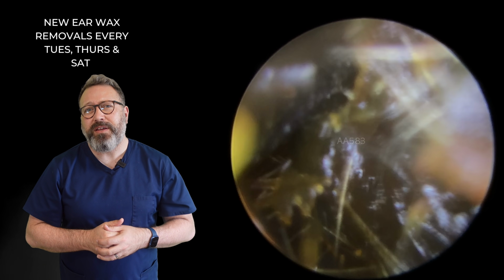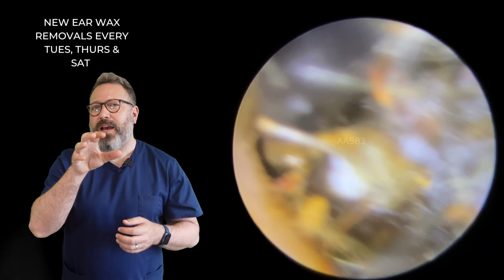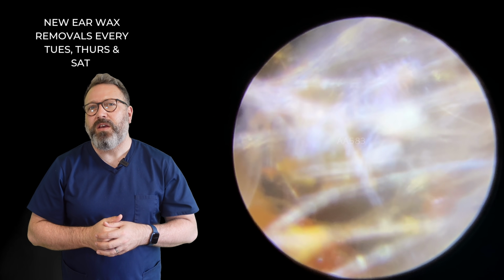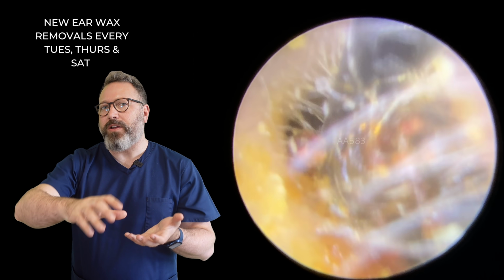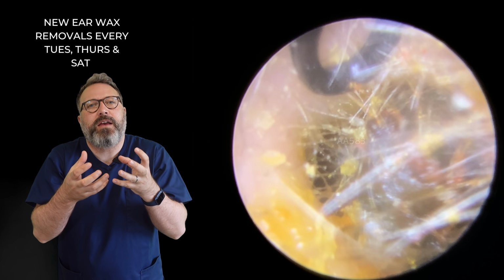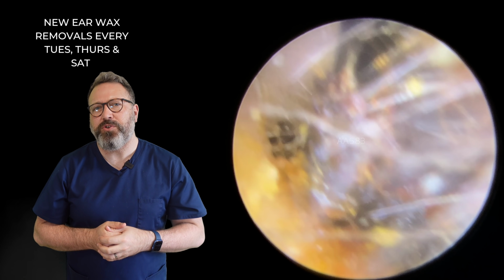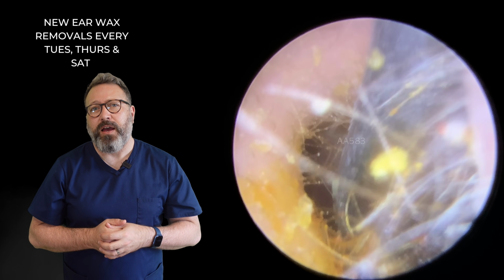So we're going to, similar story here, we're just going to use the St. Barts hook. Now the difference with this side, as we start to pull this forwards, what you'll see is the St. Barts actually pulls through the wax. So not quite as solid on this side, more of this sort of sticky clay type wax. So we're going to switch now to the Jobson horn while it's just at the entrance here. We're just going to scoop this out of the ear canal.